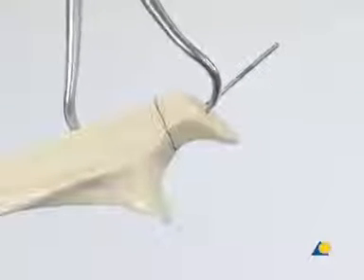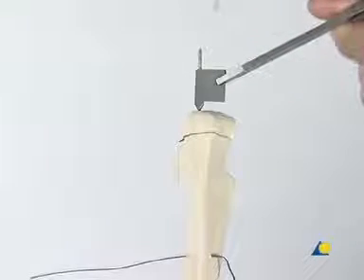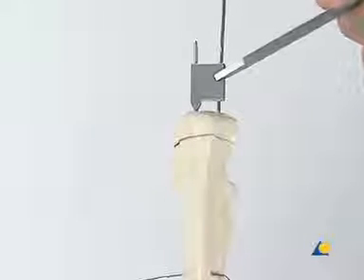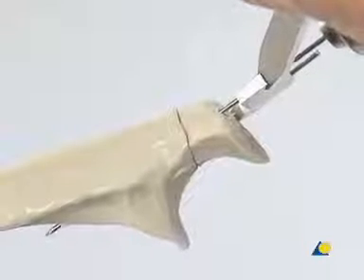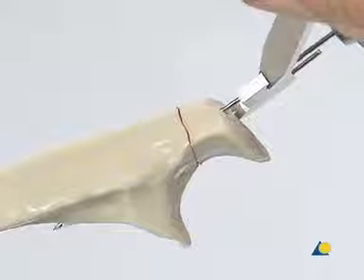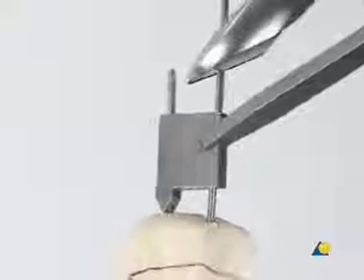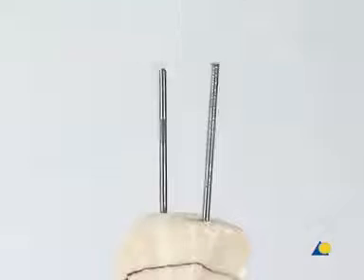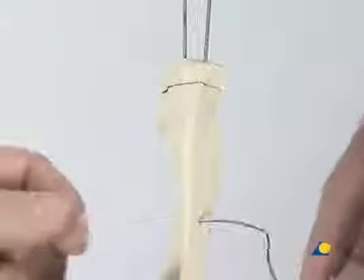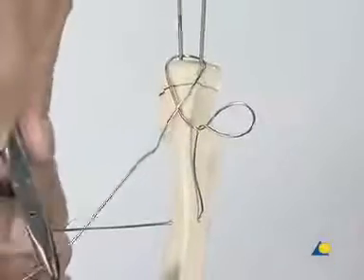The reduction forceps is now removed. The drill guide is put back in place and positioned for the introduction of the second K-wire, parallel to the first. After perforating the anterior cortex, this K-wire is also retracted 1 centimeter. The second K-wire is also cut obliquely with the wire cutters. The drill guide is removed. The end of the cerclage wire that has the loop is wrapped around the two K-wires in a figure of 8. In clinical practice, the wire is passed beneath the triceps tendon, just next to the bone.